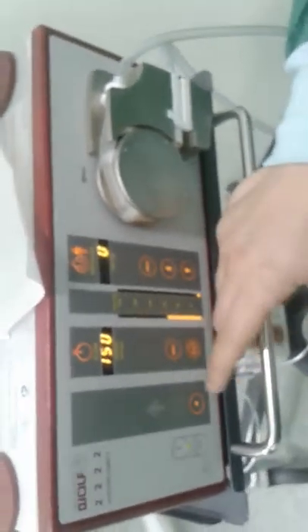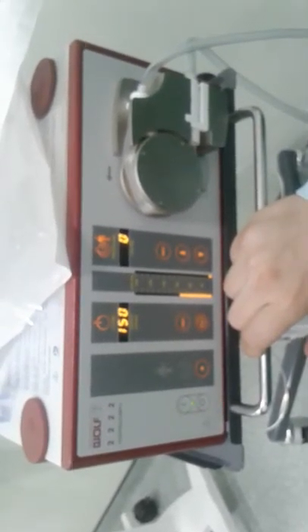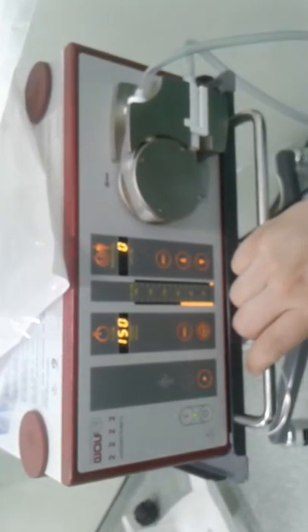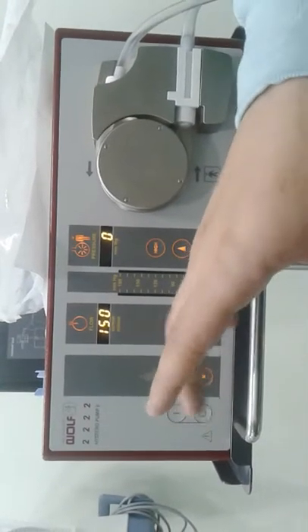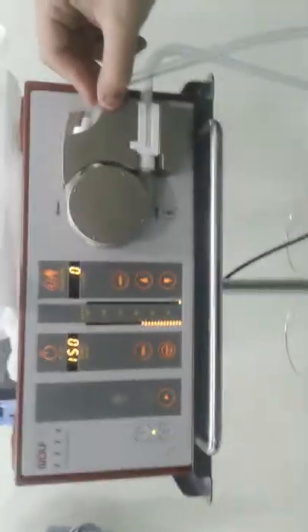Alright. Hysteroscope is connected, inflow bag. Okay, let's talk about the front panel of the device. Okay, let's start. This is to turn it on and off. This is for if there is a service problem or you need to call the service, this will light red, or if the tube is not connected well.